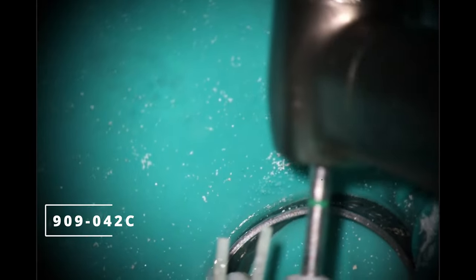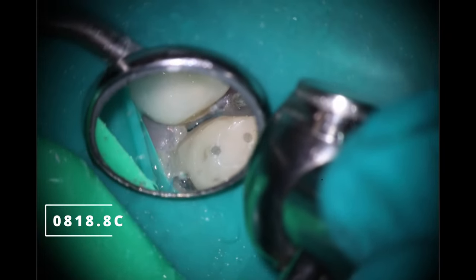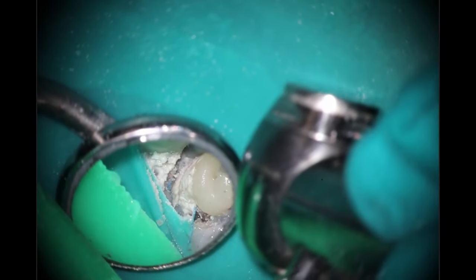Starting off with the wheel burr to quickly pop those two posts on top — that's a wonderful thing about fiber posts, it's very easy to cut. Now coming in with the prep burr to reshape that whole area, going down to where the cord is. I like to leave everything nice and flush between where the crown and the tooth meet. That makes it so that when the gingiva heals up, it heals up nicely. If you do a crown prep right now and leave it, the gingiva likes to grow over the actual prepped margin area and it's not healthy — this is a learn-from-my-mistakes thing.